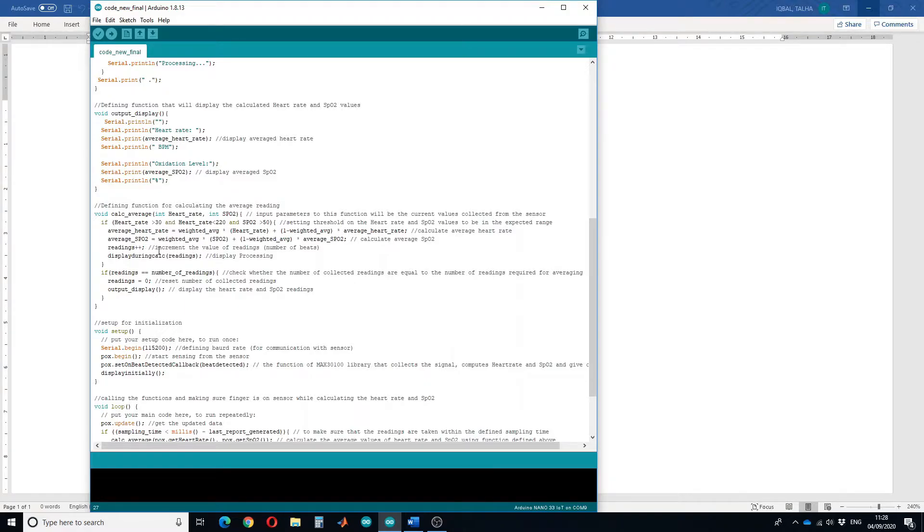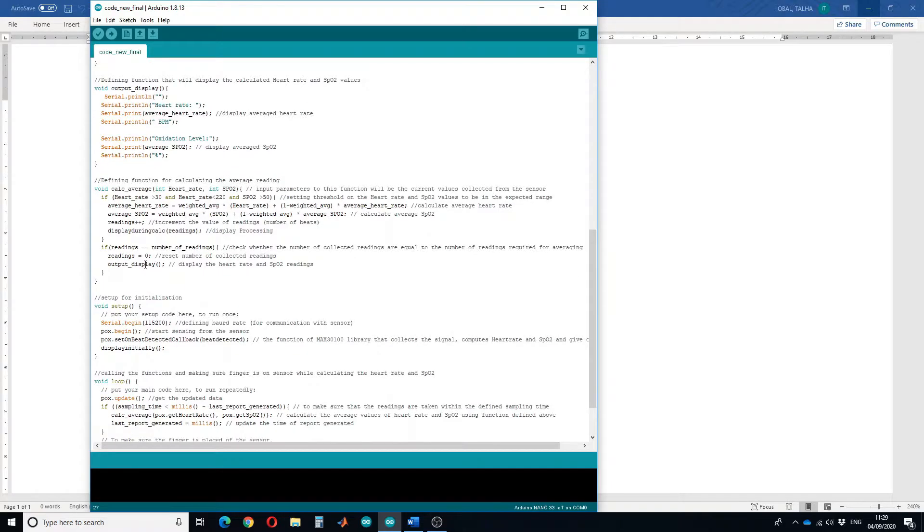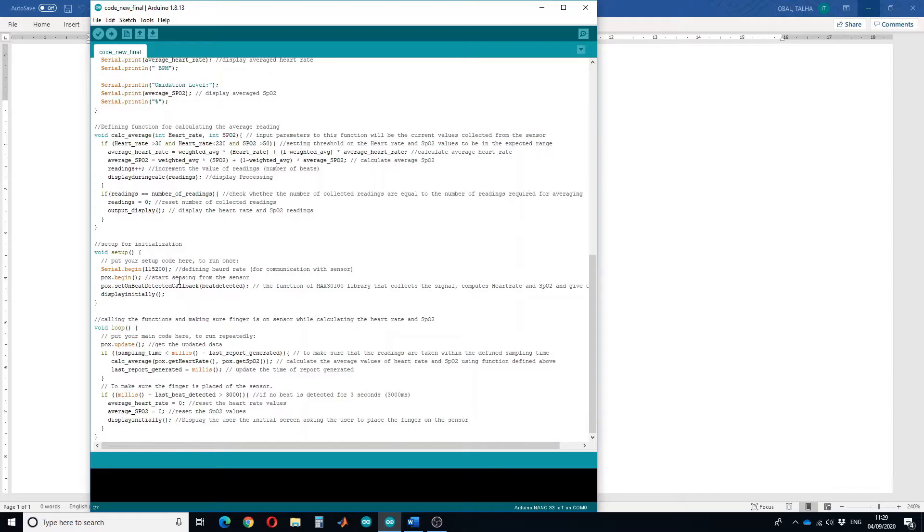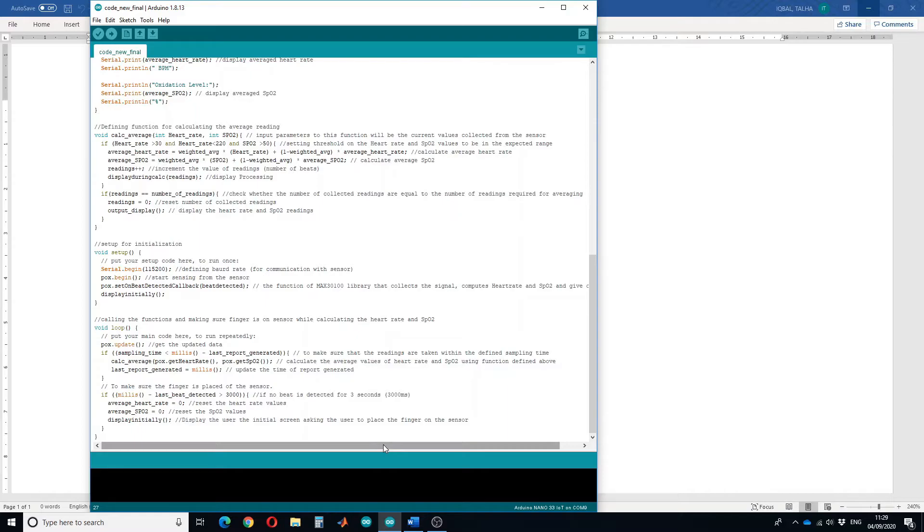Let's initialize all the things. In the setup we have set the baud rate of 115200 and then we have started the sensor. We have called a function of MAX30100 library that collects the signal and calculates heart rate and SPO2 and gives us the output. We will initiate the display at the start as well.